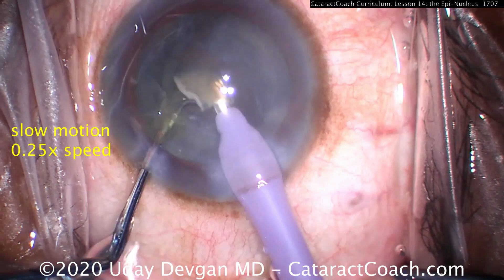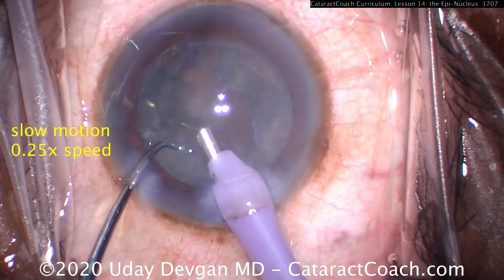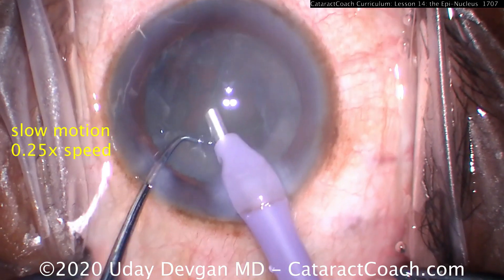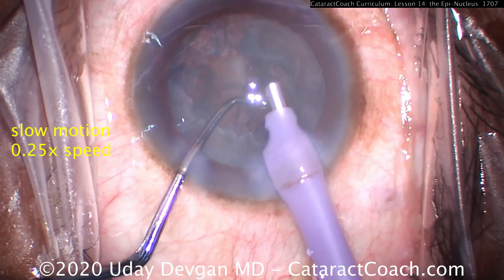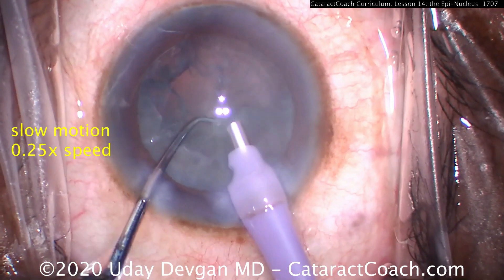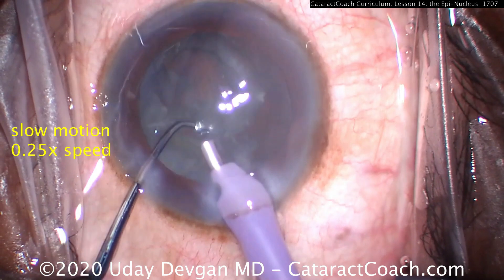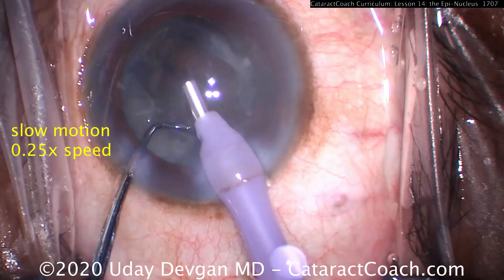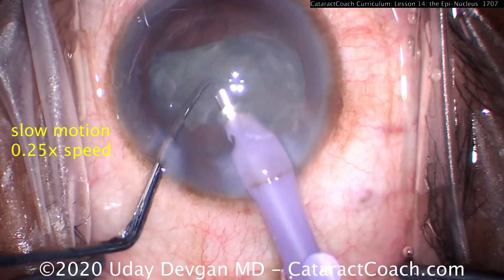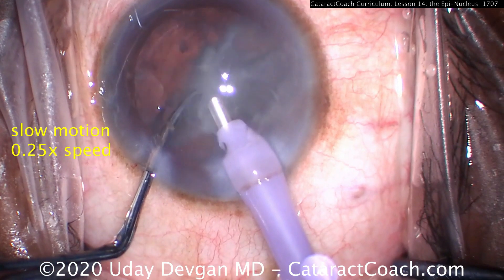Here's removal of the last nuclear fragment. Now there's a thick epinuclear shell in the capsular bag, already loosened up from hydrodissection and hydrodelineation. Removing the last bit of nucleus — now with the epinuclear shell, we're staying on the same chop setting using just vacuum, zero ultrasound power. The goal is to grab that distal end of the epinuclear shell. Nice and easy with the chopper there to protect. And once we grab it — there it is — we grab the distal end. The chopper now helps to flip the epinucleus upside down; look at the motion of the left hand, that chopper pushing forwards to flip it. Once it's flipped, it's away from the capsular bag.